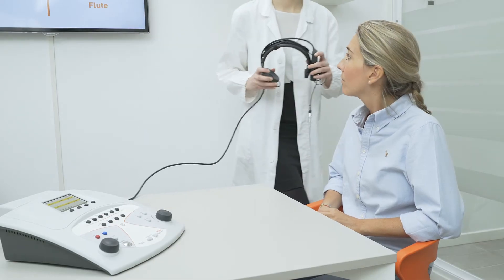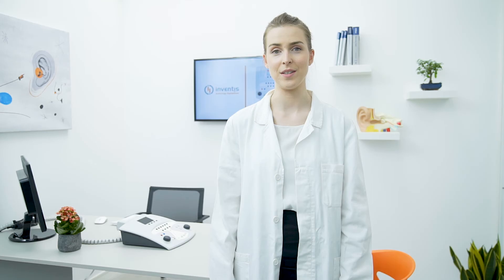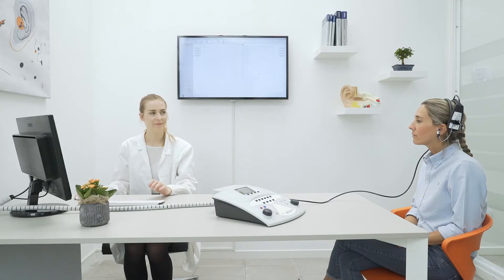Also available are two user-programmable automatic sequences, as well as reflex decay tests and Eustachian tube function tests for intact and perforated ear drums. Surely the best characteristics of Flute are its endless flow pump technology and its finely designed probe.